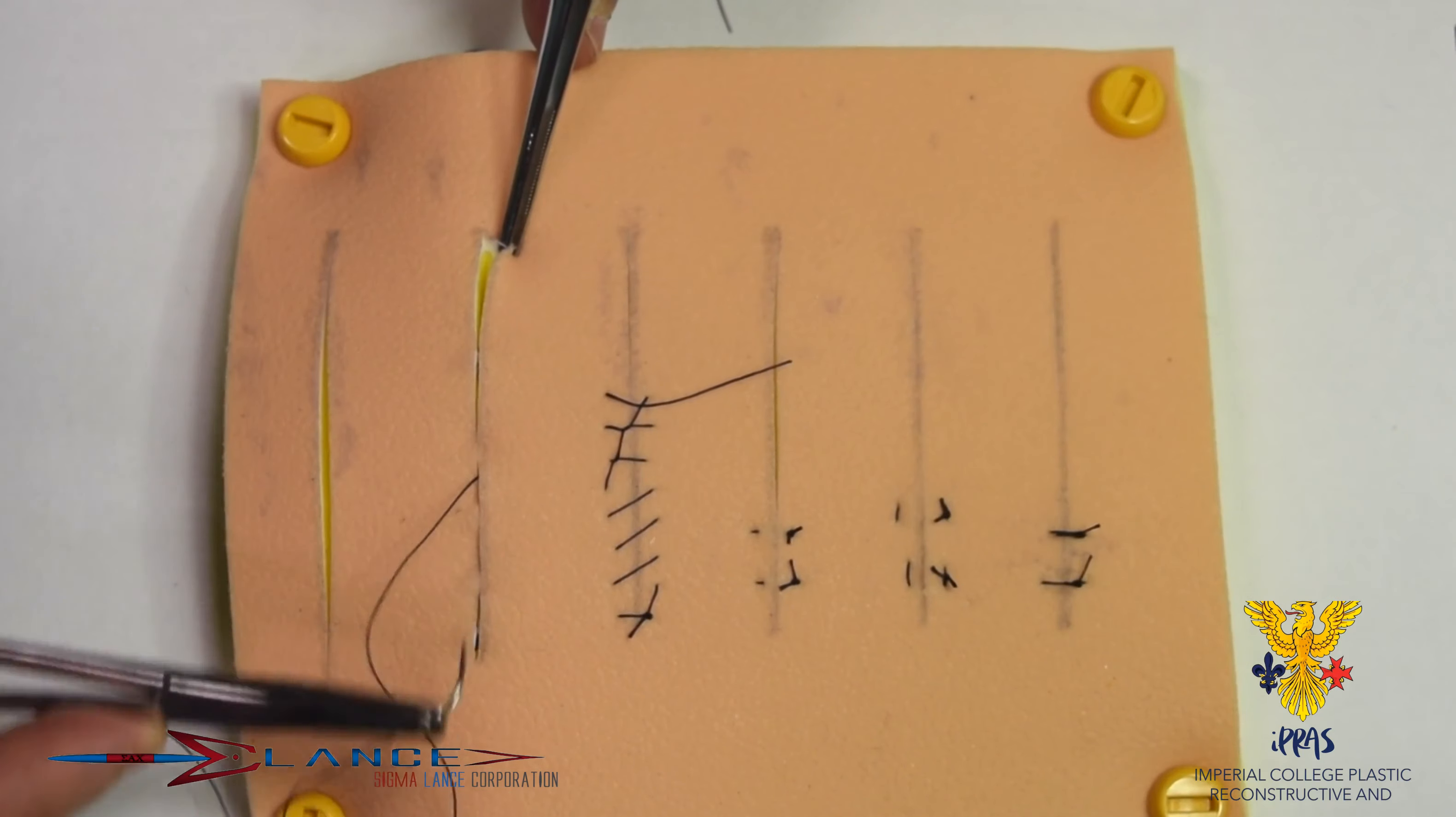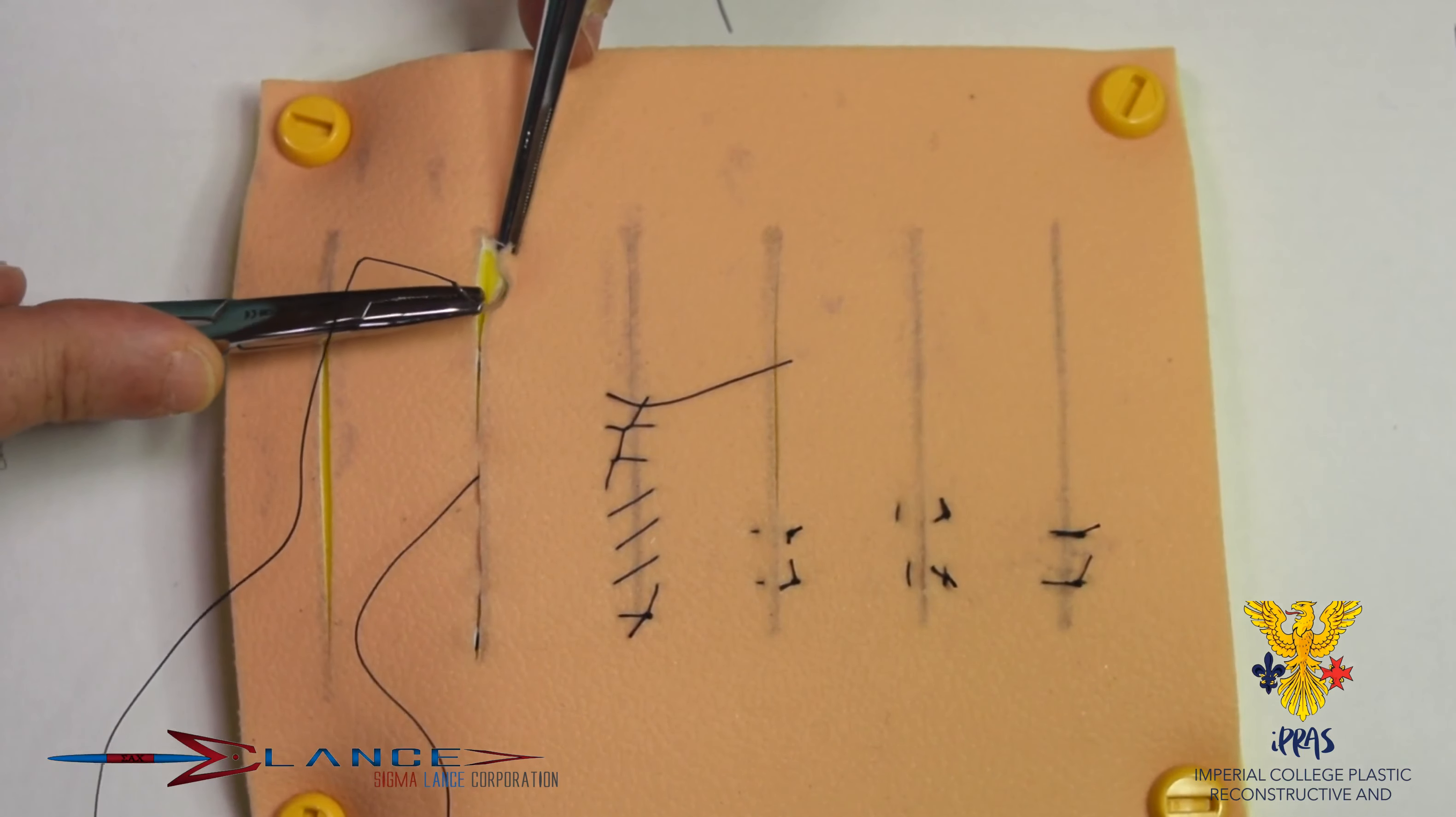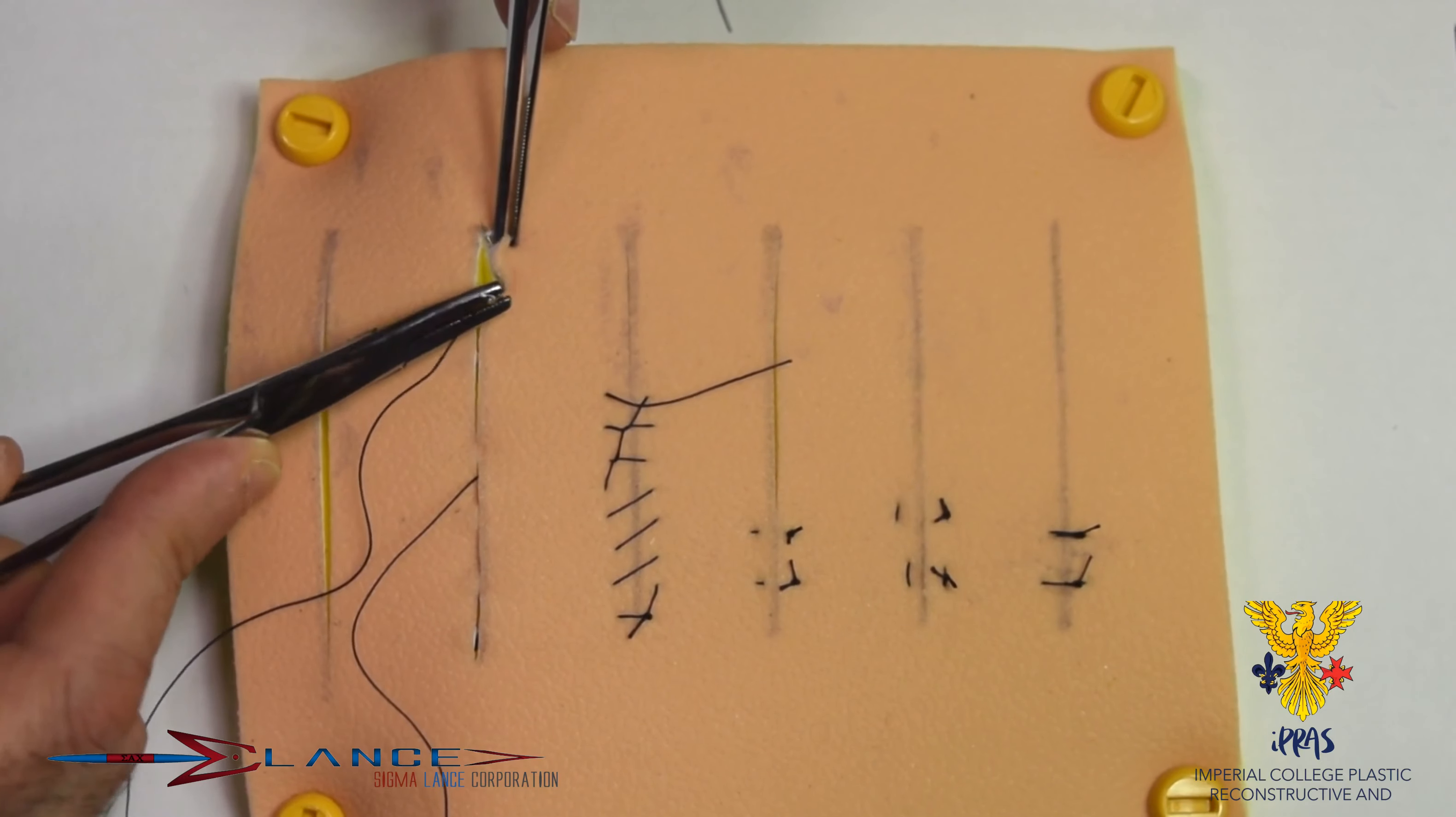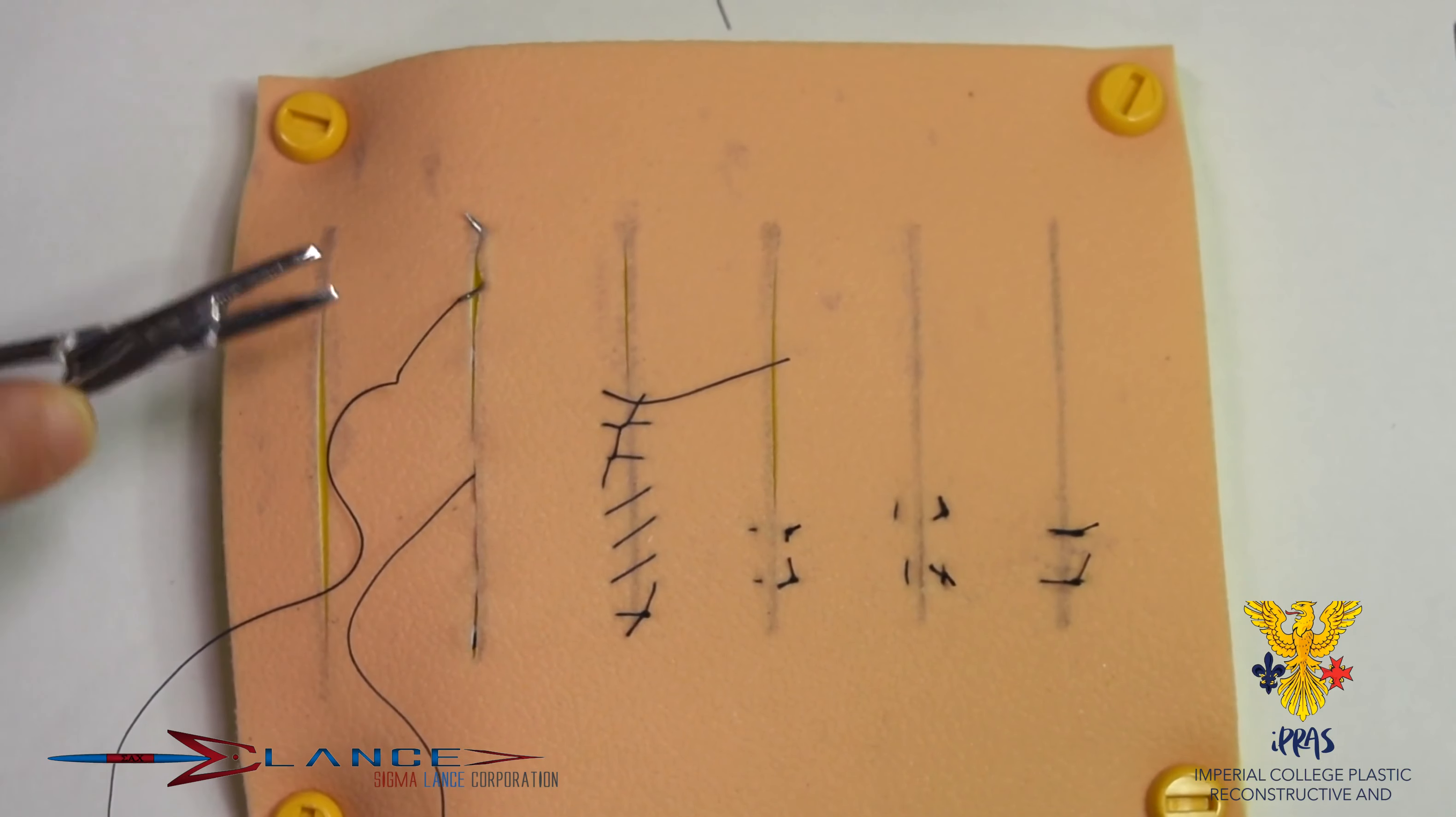And again, you tend to finish off on the opposite side too, because that's easier to see. And essentially involves taking a bite as close to the corner as you can.